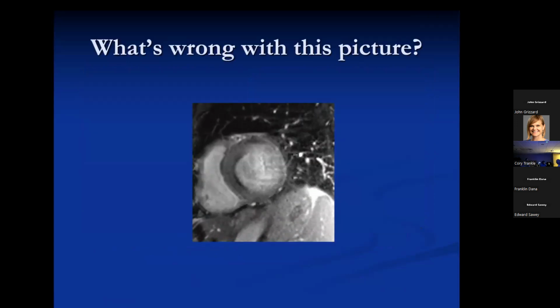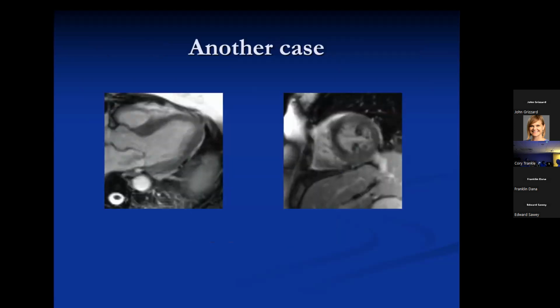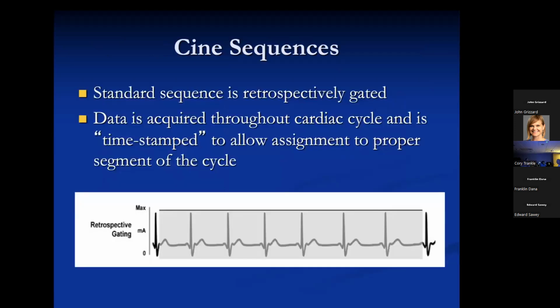Here's another one. Is the diaphragm moving? Really not. That's pretty still, right? So what's going on in those sequences is that you're having arrhythmia.